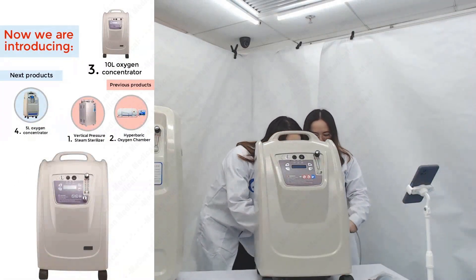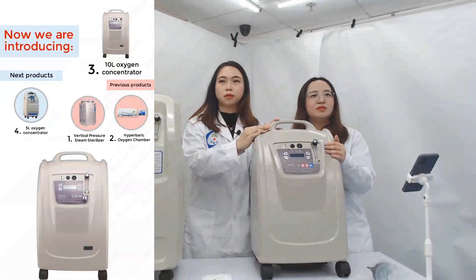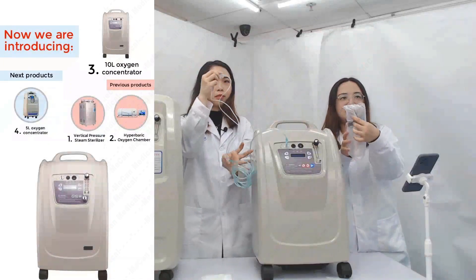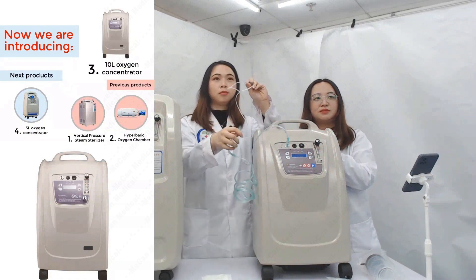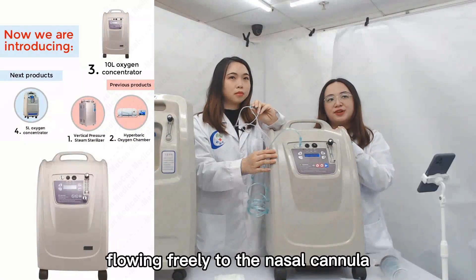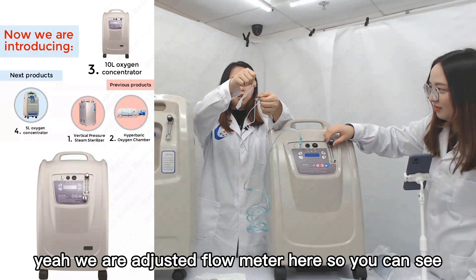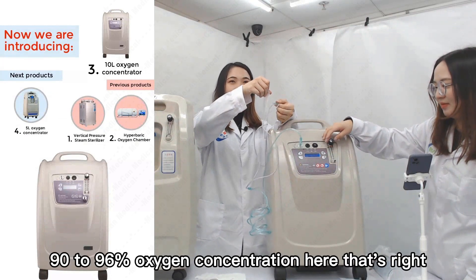Here is the power cord. First, we need to connect the nasal cannula to the gas outlet. If used, we can also connect it to the humidifier outlet connector. Now let's turn on the machine. With the oxygen concentrator turned on, you can adjust the flow meter to the desired flow rate, and the gas should be flowing freely through the nasal tube. Now let's adjust the flow meter — you can see the oxygen flowing at 90 to 96% concentration.